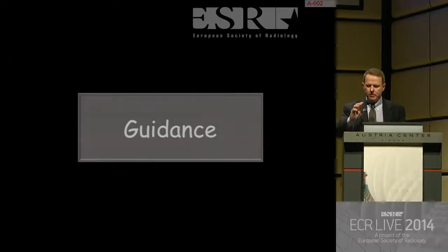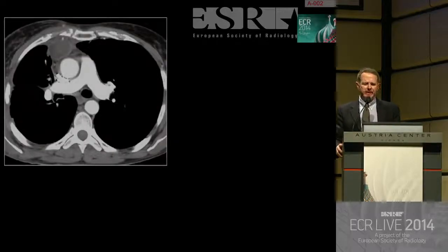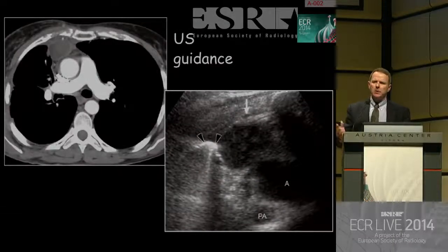Guidance. I started my work a long time ago, in 1981, with ultrasound, and of course I am an ultrasound fan. And any time that I have a lesion that can be biopsied with ultrasound, I tend to do so because ultrasound guidance is very useful. Why do I do that?